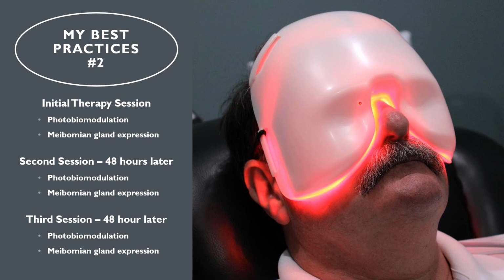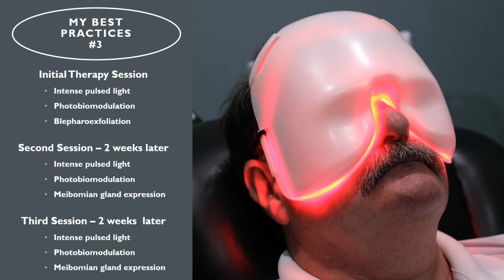What if the patient can't come back every 2 days? I mean, they're traveling salesmen. They're here, they'll be back next week. Okay, so there's times where you can't do this, where you don't want to do this, where this might not work. Okay, then you go back to number one, or you can do it a different way.